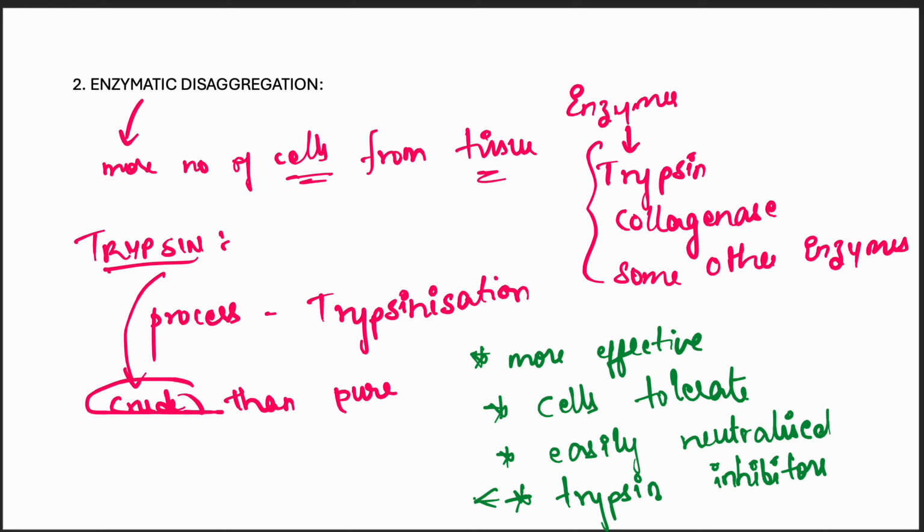And crude trypsin is easily neutralized in serum media.